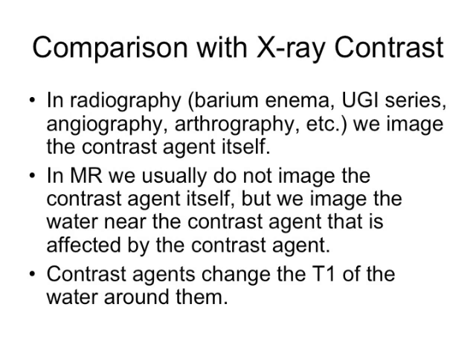Now, we've said this before in a previous module, but we're going to cover this again. In radiology, we image the contrast itself. If you're doing a BE, an upper GI, and you're seeing the contrast on the film, you are looking at the actual liquid. That's not the case in MRI. In MRI, we inject the contrast or we drink the contrast, but we're not capturing the liquid on the image.